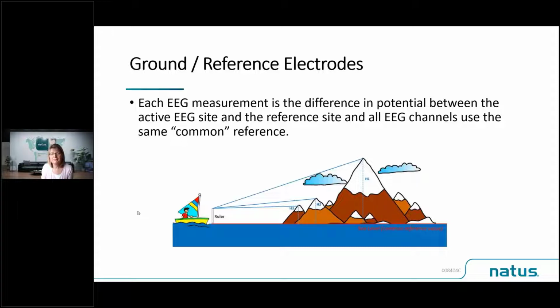Now, let's imagine the measurement of the altitude of the mountains and hills from a boat navigating on the sea. The 0 value of this ruler must be in accordance with the sea level. That's your 0 level. In order to be able to measure these different altitudes, you've got to have a 0 point to be able to measure your altitudes.